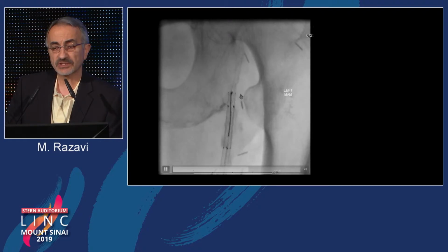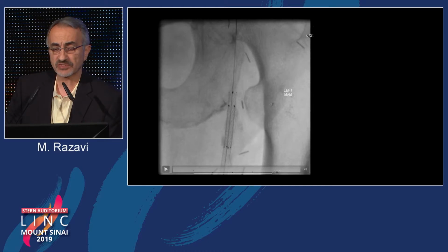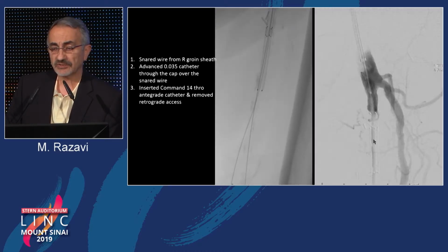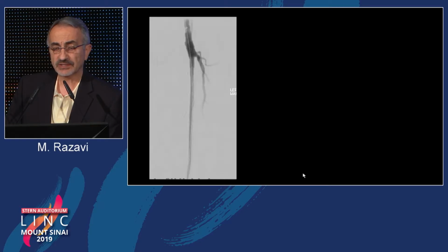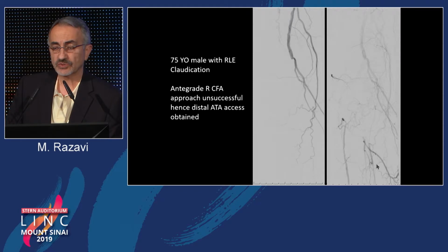In this location it is okay because we had a bit of a stump. Here we go, we get through, and then you actually do your intervention from the other side. And here it is, you do your intervention, you get through, and so on and so forth.